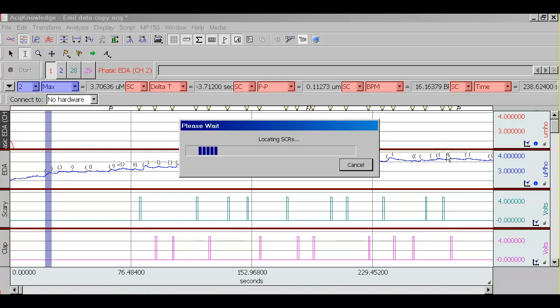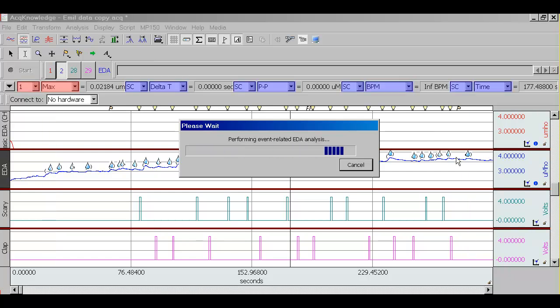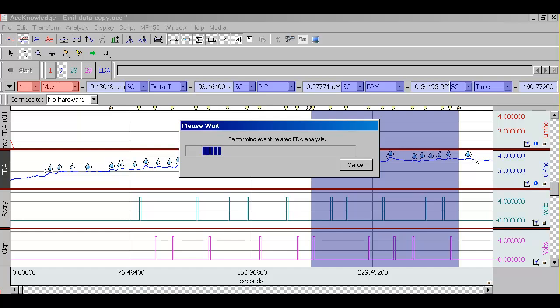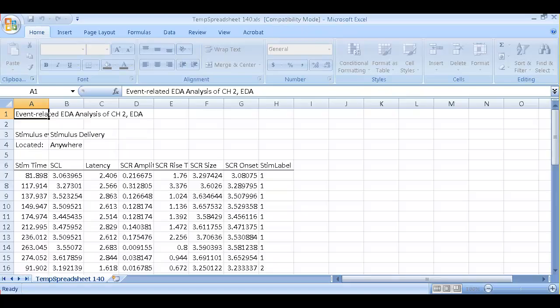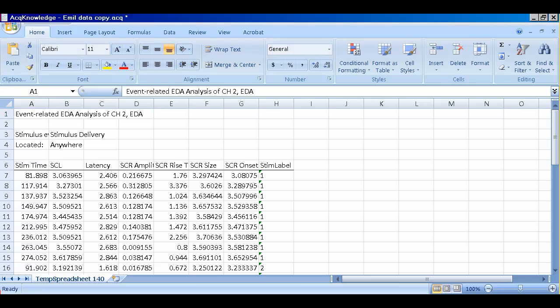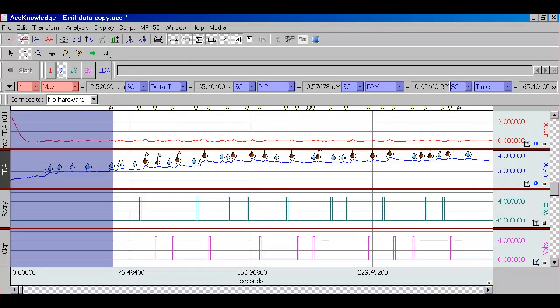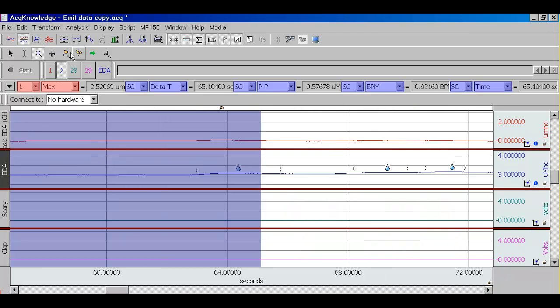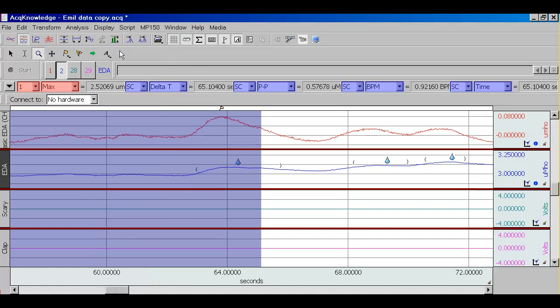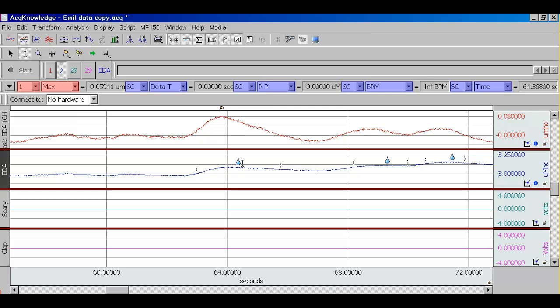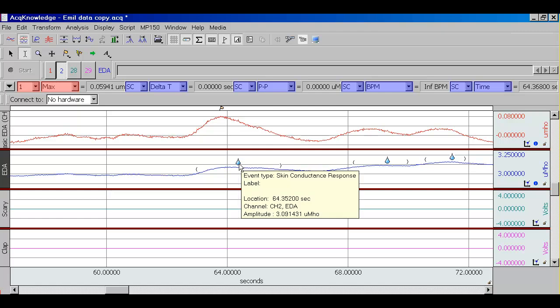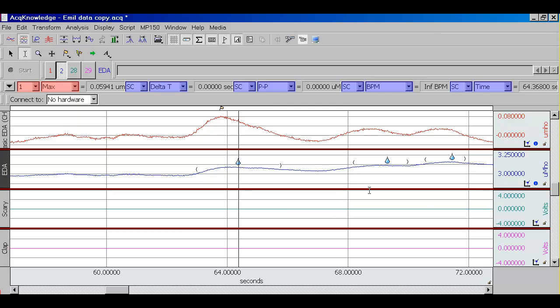We'll go ahead and run the analysis now. These open brackets that you see appearing denote the onset of skin conductance events, while the closed brackets are the end of the skin conductance events. An Excel file is generated with the results. Let's zoom in on the data and autoscale all the waveforms. We can see here we have the onset, the end, and the peak of the skin conductance event. These are marked on the channel that had the tonic skin conductance recording, so the raw skin conductance recording.